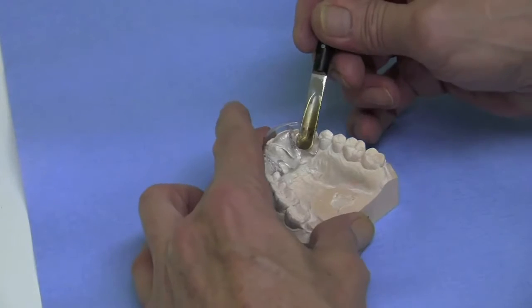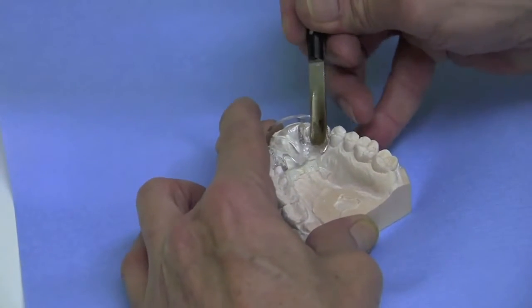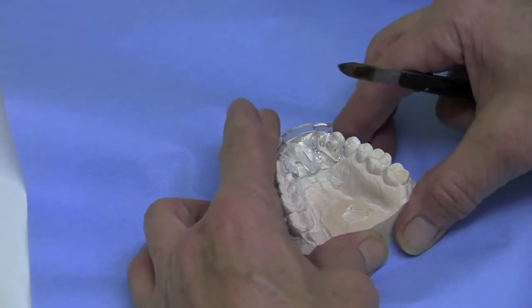The softened polymer can be adapted with an instrument such as the wax spatula shown here. There is some memory effect, so maintain the pressure until the splint is cooler.